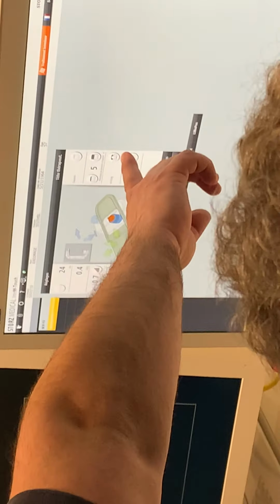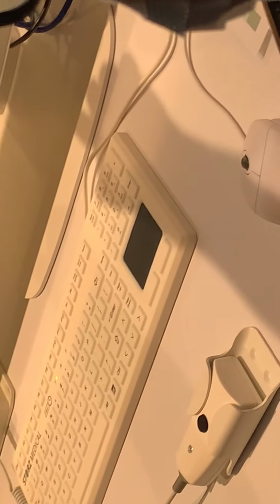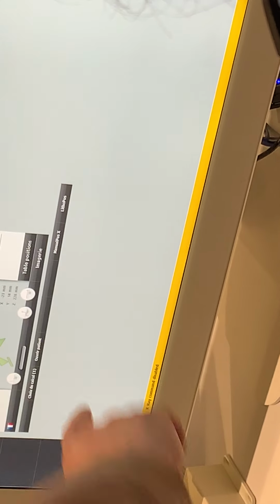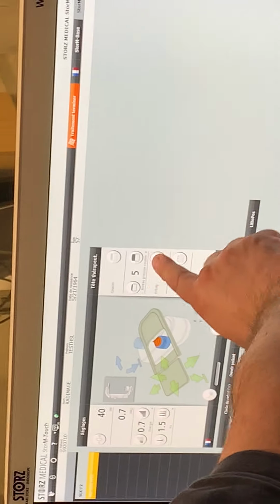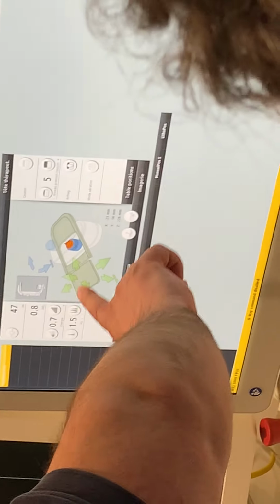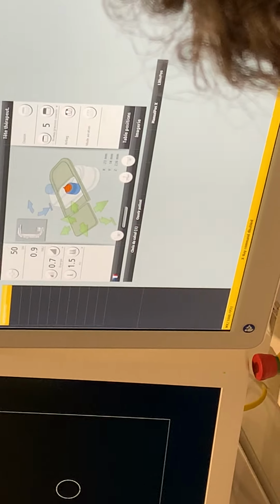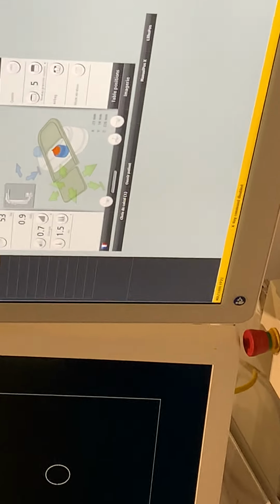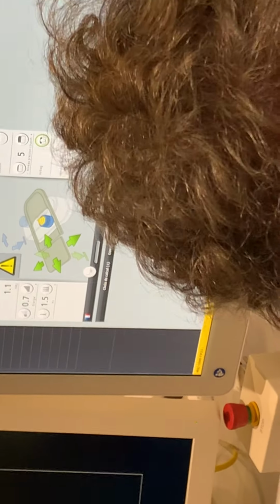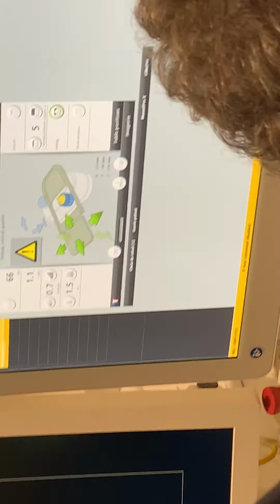And the airbag, yes, I pressed the button. Now the airbag deflates. The airbag is off. It is not green shaped anymore. And I also cannot activate the airbag when we shoot. And I cannot move the table. It's like the other machine. Now I want to check the stone, but I do not have an airbag. See, this is now not efficient for me.